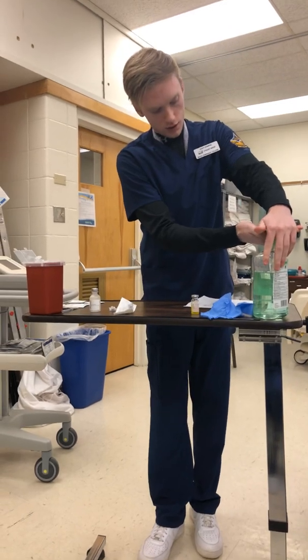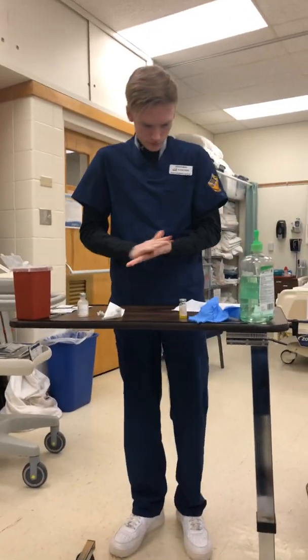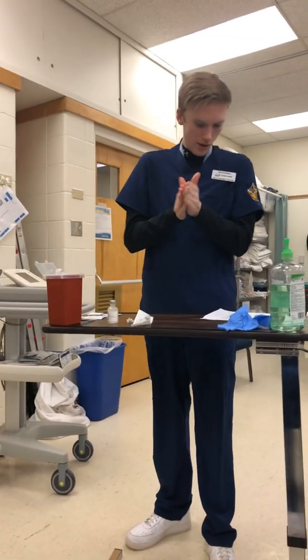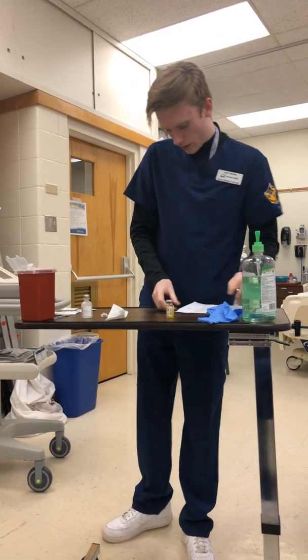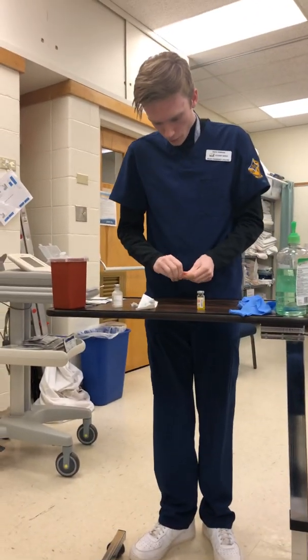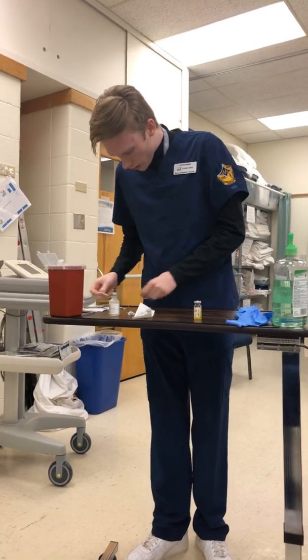Now I'm going to wash my hands again. Double check again that the medication has dissolved, in which it has. And now that that's done, I'm going to clean the top yet again.